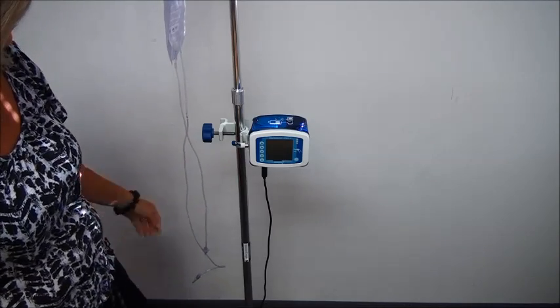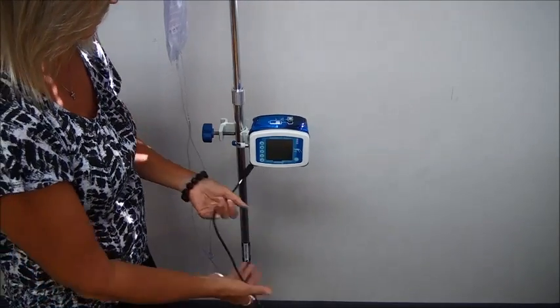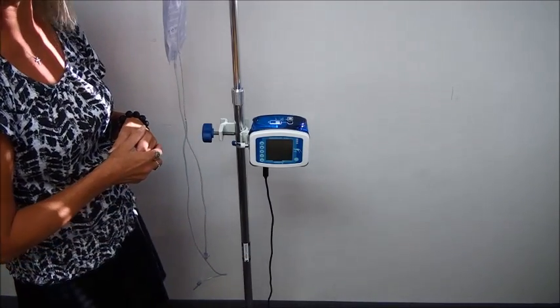The first thing you want to make sure of is that you have the pump firmly attached to your IV pole and that you have your pump plugged into your wall outlet. The next thing we're going to do is install your pump set.